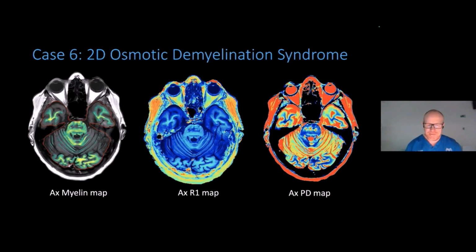Patients don't tend to do very well with these. But when you're looking at something that can be subjective looking, being able to measure this with mapping and look at treatment therapies to see if there is any sort of recovery on these, this type of quantitative imaging is extremely powerful in seeing if they are getting any improvement. This is an area that they don't often get improvement, as I said. So being able to look at therapies and find a therapy that would work, this would be very powerful in developing new therapies.